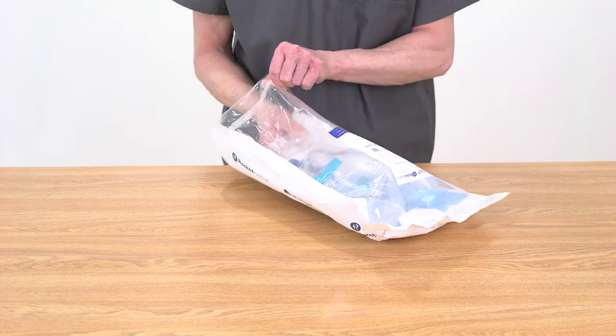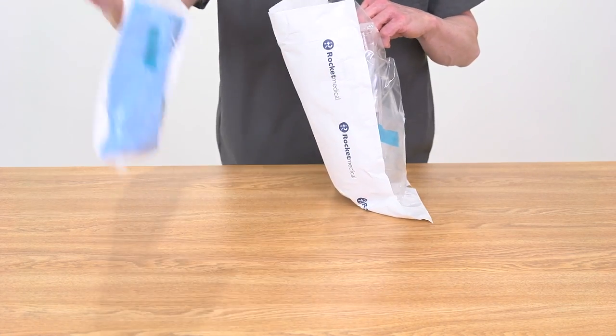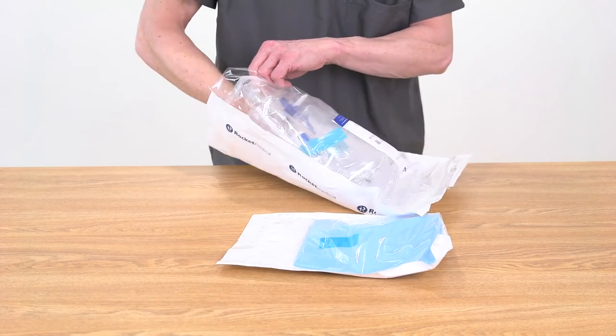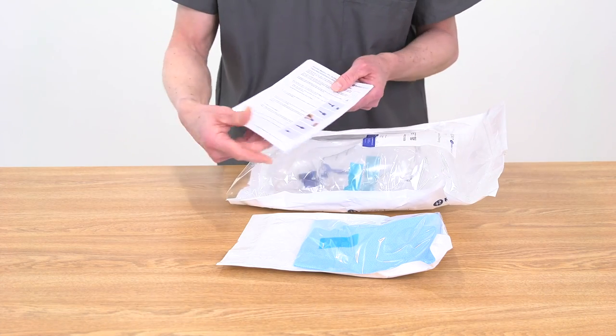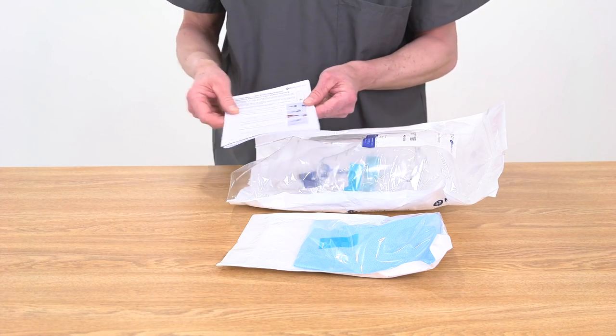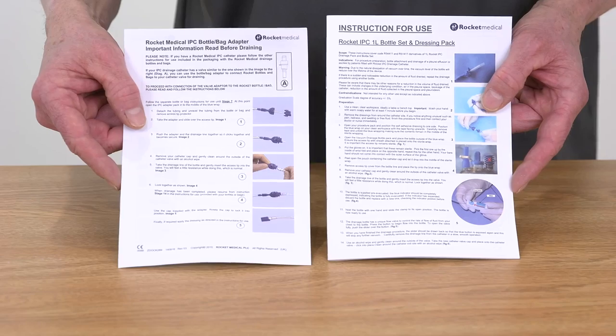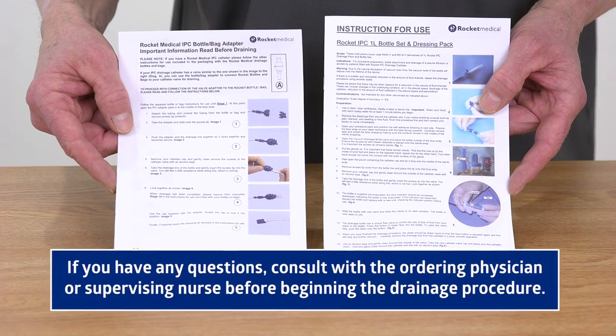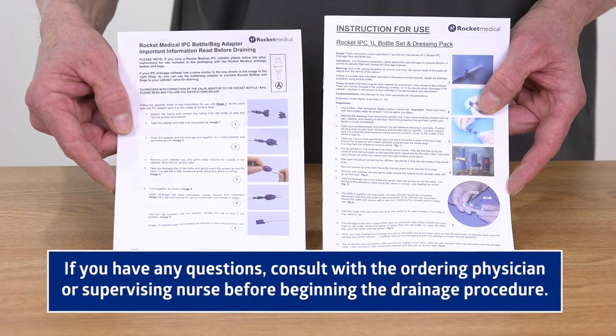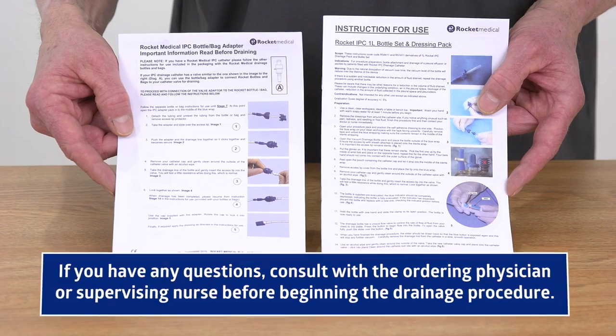Make sure you have a clean, clear workspace, ideally a table or benchtop. Open the ROCKET IPC Drainage Kit Sterile Package. Remove the procedure pack from the kit and place it on your clean workspace. Leave the bottle in the bag. Take this time to review the instructions included in the kit. If you have any questions, consult with the ordering physician or supervising nurse before beginning the drainage procedure.